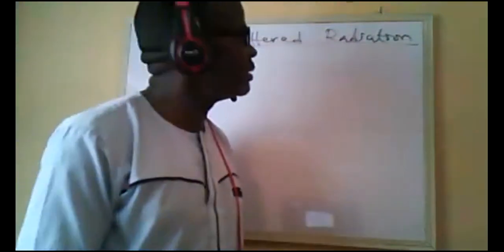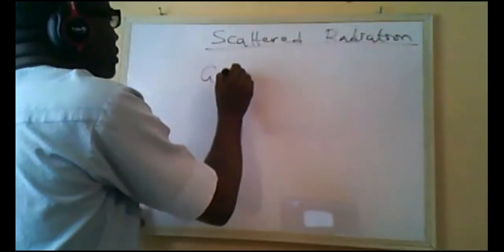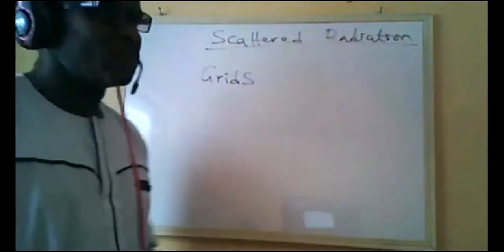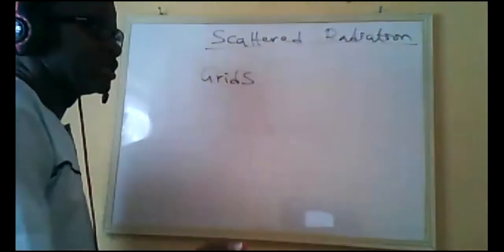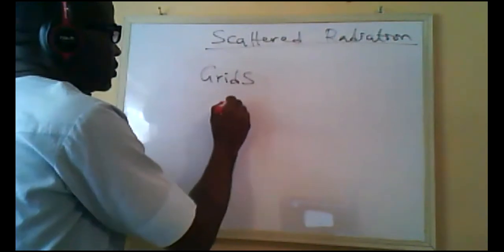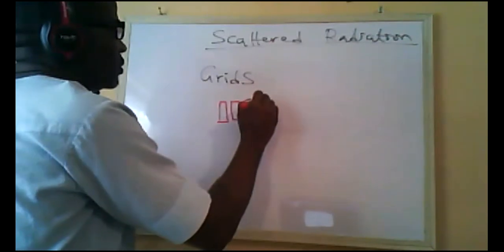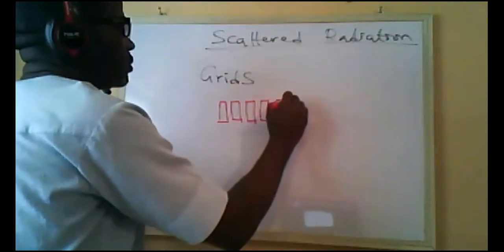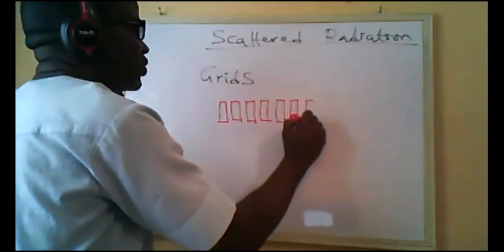So with that, we use grids to make that come about. And the grids are simply, just a two-dimensional grid.